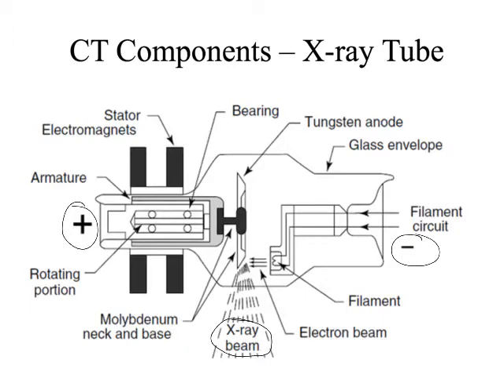Because energy can be neither created nor destroyed, it just has to be continuous, it changes forms. So the stopping of that produces an X-ray. And it can be a wide spectrum of X-rays.